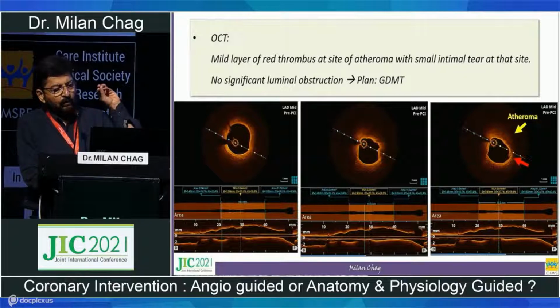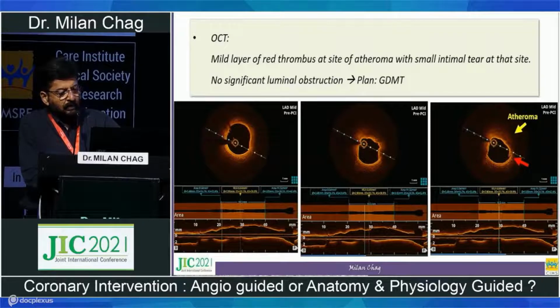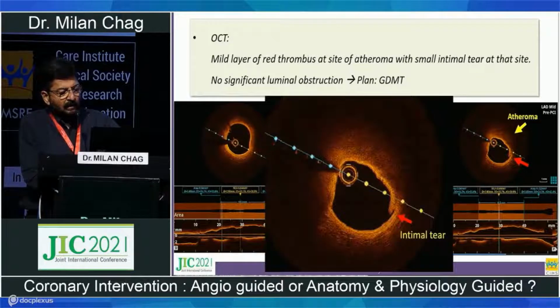So here you pass an infrared camera inside the artery over a guide wire like a PTCA balloon. It actually sees the lumen. So the entire lumen is seen, and this is some enlarged thing, and this is a large lipid pool. This bright structure is fibrous tissue, which is a very stable thing, while this is a lipid pool, which is a thin capped fibrous atheroma.